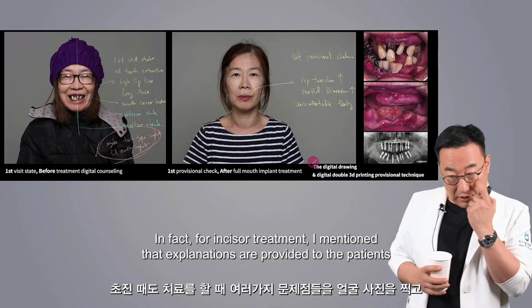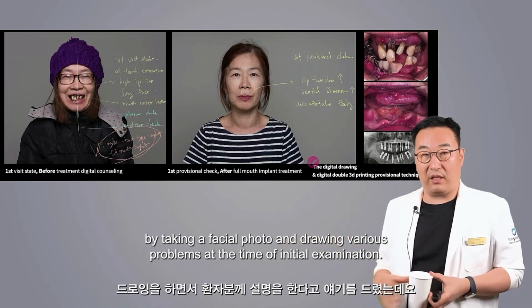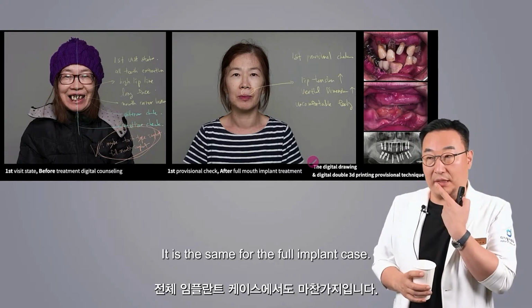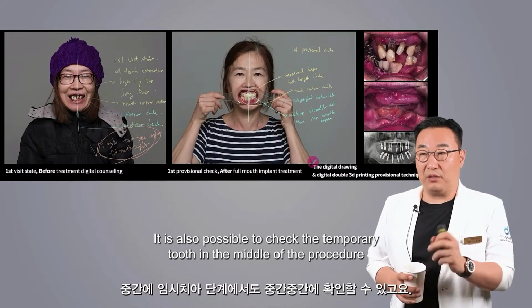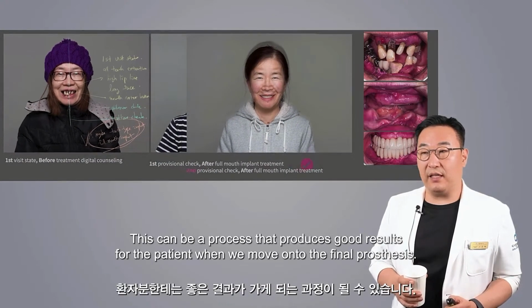In fact, for incisor treatment, I mentioned that explanations are provided to the patients by taking a facial photo and drawing various problems at the time of initial examination. It is the same for the full implant case. It is also possible to check the temporary tooth in the middle of the procedure by writing down memos in advance like this.